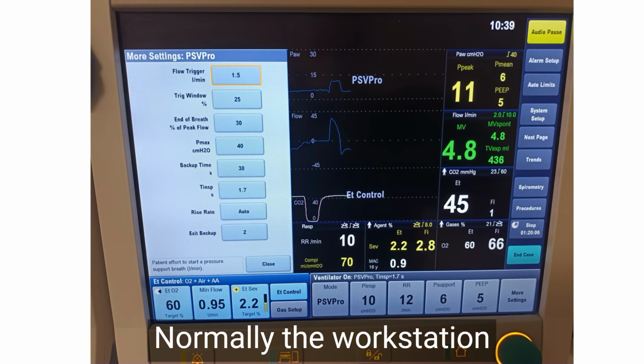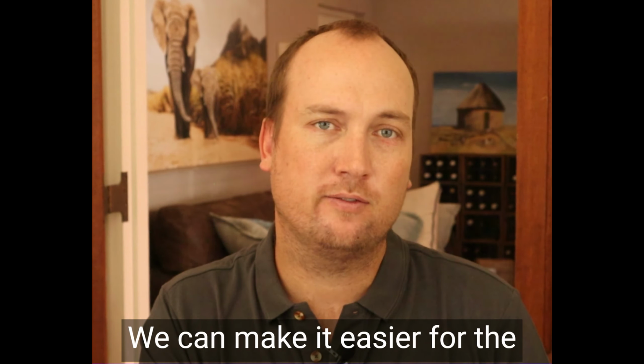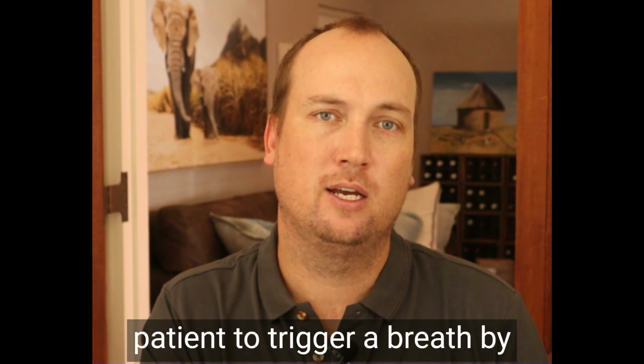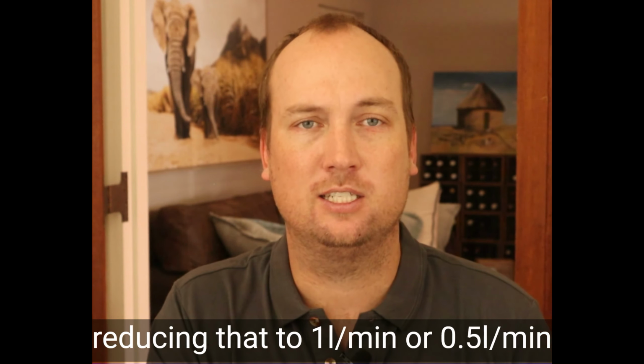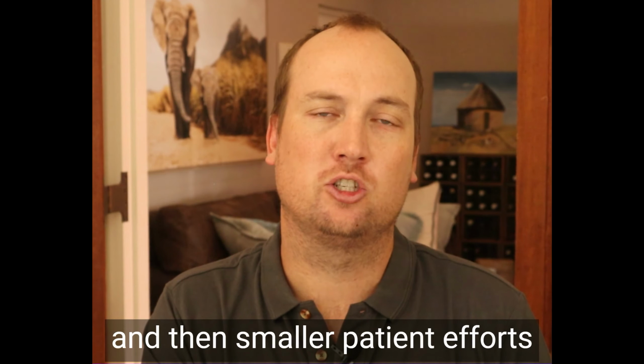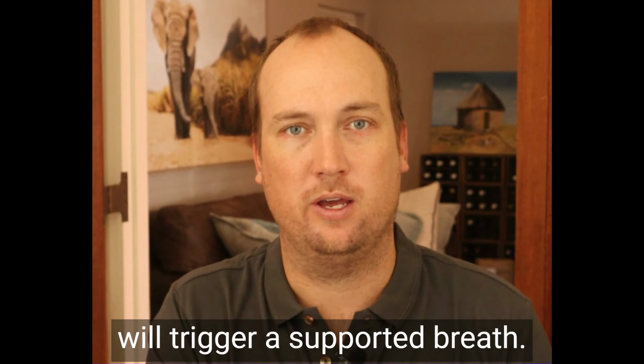Normally, the workstation defaults to a flow trigger of 2 liters per minute, but we can adjust this. We can make it easier for the patient to trigger a breath by reducing that to 1 liter a minute or half a liter per minute, and then smaller patient efforts will trigger a supported breath.